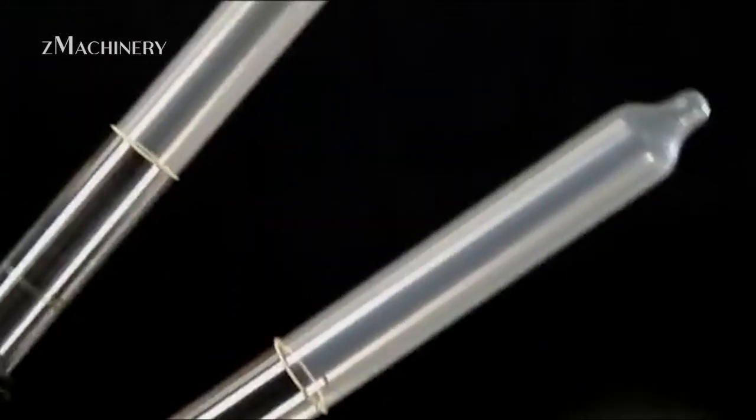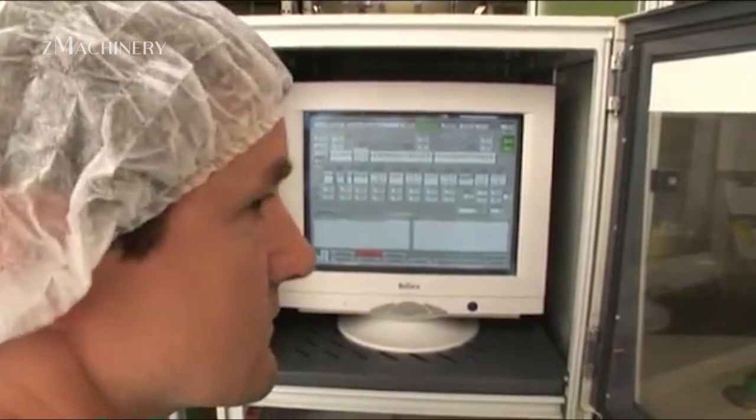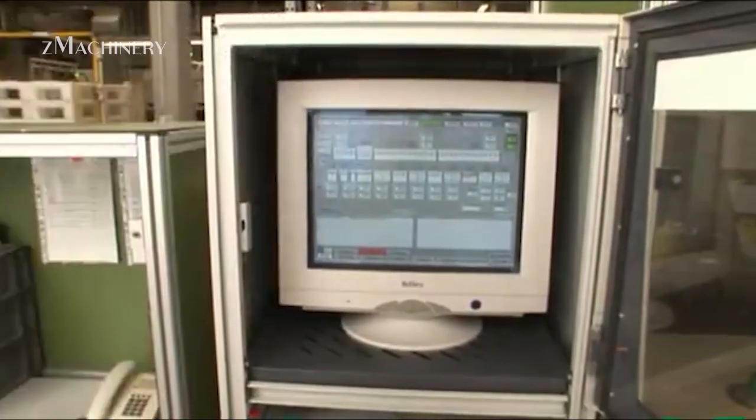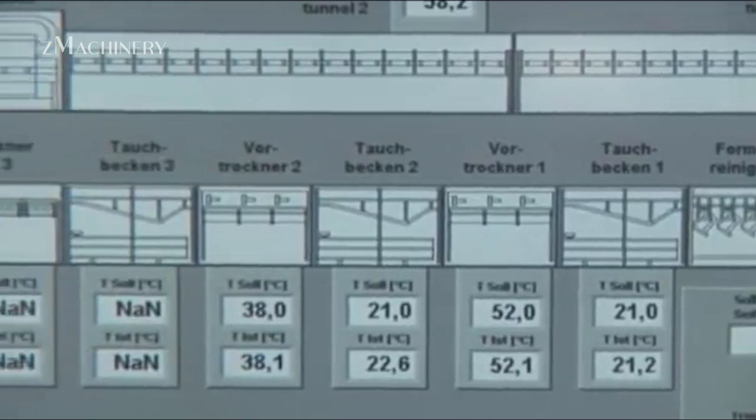Once dipped, the molds travel through a series of ovens in a process called vulcanization. Vulcanization is the heat treatment that strengthens the rubber and gives it the flexibility and resilience required to do its job reliably and safely.